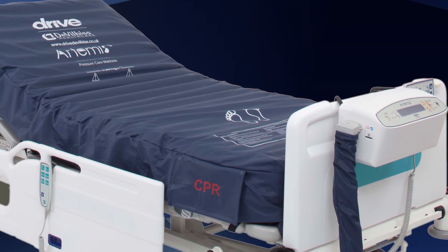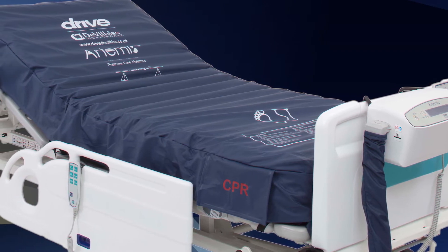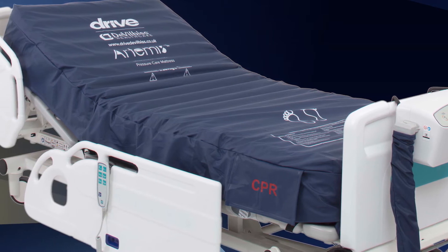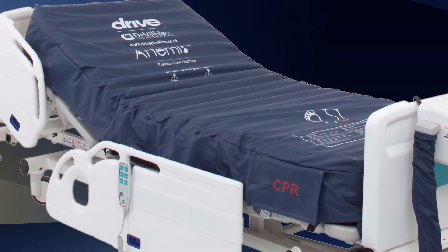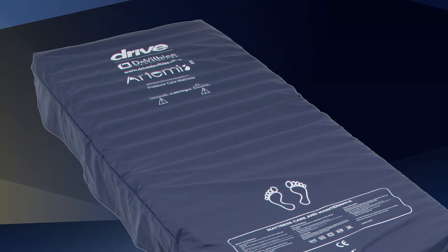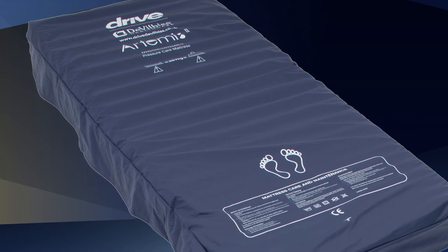The Dynamic Pressure Therapy Mattress is a replacement mattress with a one-in-two cell cycle system. There is fully automatic pressure adjustment determined by the patient weight and positioning. The mattress has three zones — the head, the torso, and the heel — which provide optimum pressure redistribution.